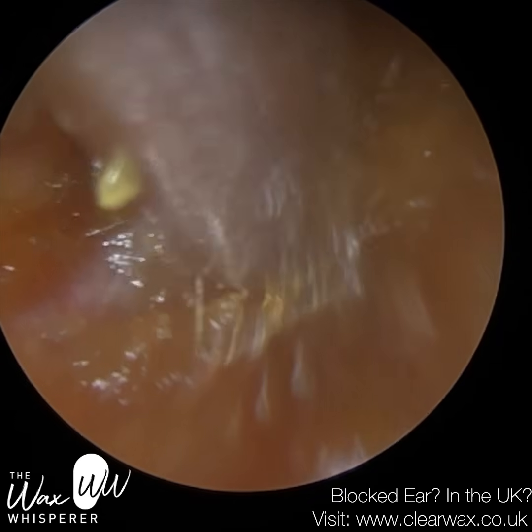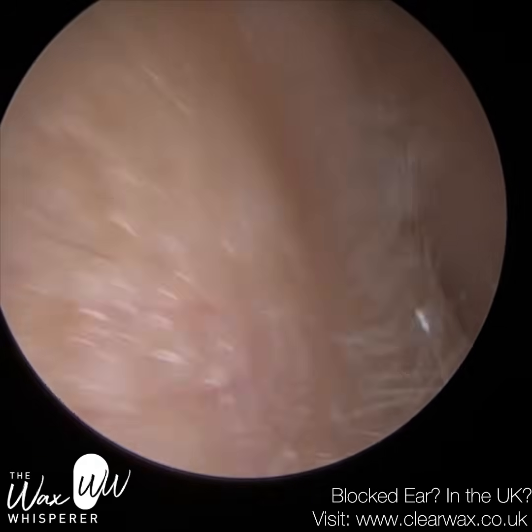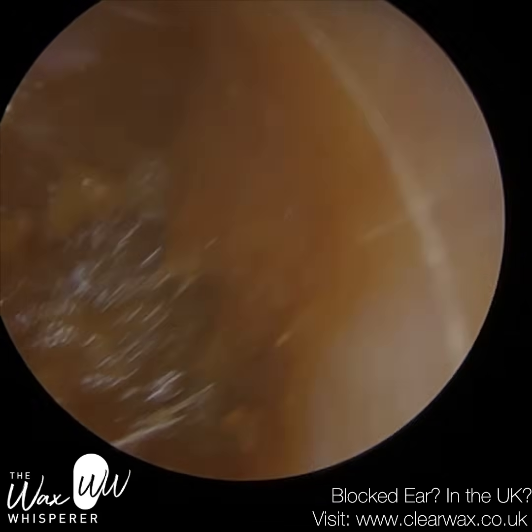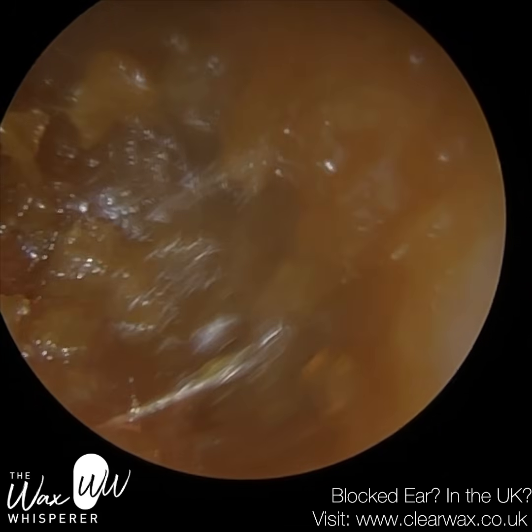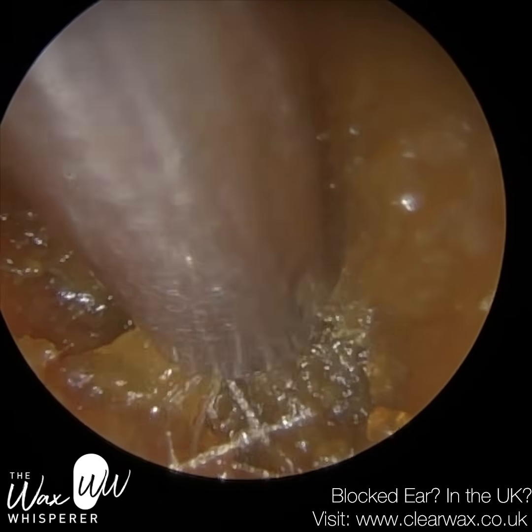And what actually happened is that this wax and dead skin had got softened, and once it had got softened, it just drizzled further down towards the eardrum because of gravity, and it made it quite difficult to remove. They also used drops that I'm not very keen on.